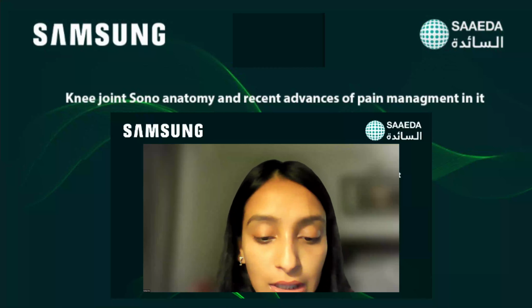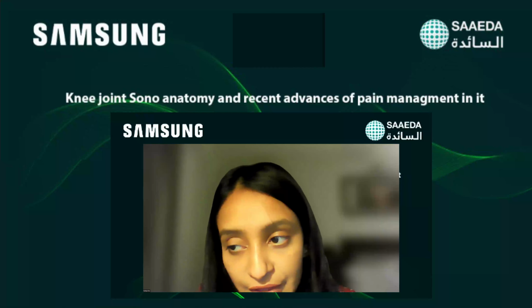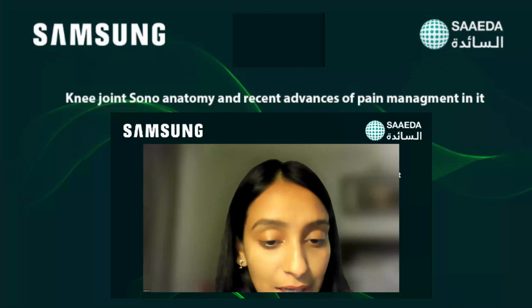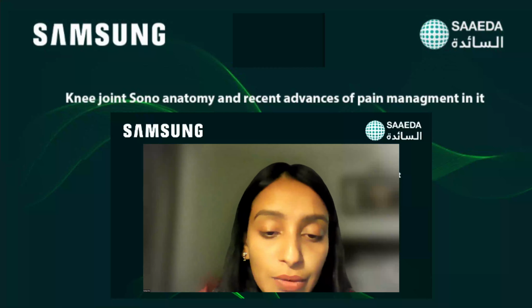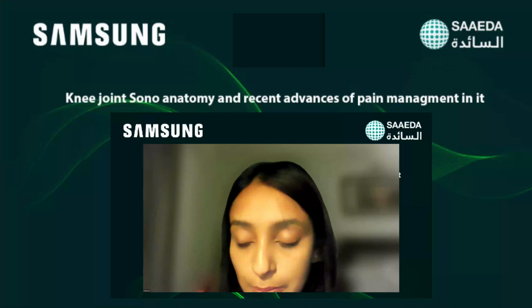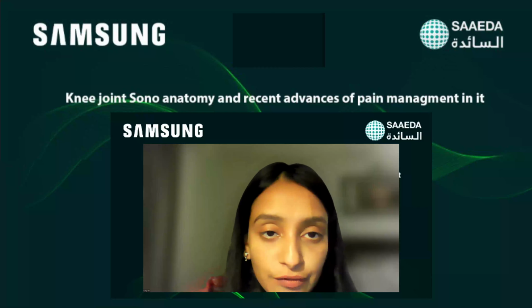When we are doing a conventional radiofrequency ablation, it causes thermal lesions, and cooled RF produces larger lesions. In the case of pulsed radiofrequency, again, the lesion size is not that much, and the temperature, as we know, is much lower than the conventional. So with pulsed radiofrequency, the results are not as good as with conventional radiofrequency.